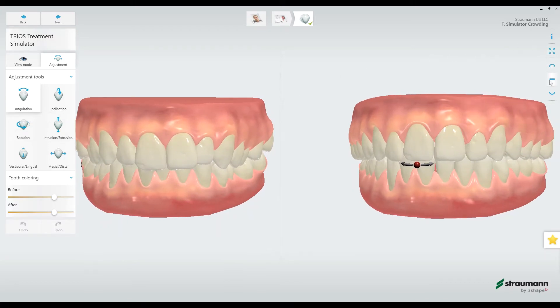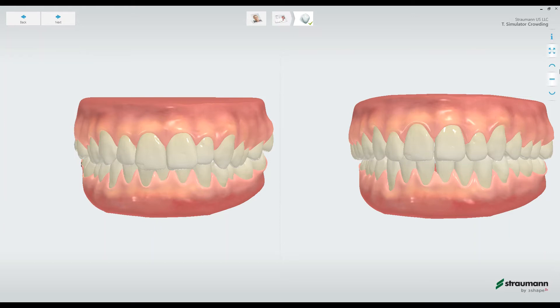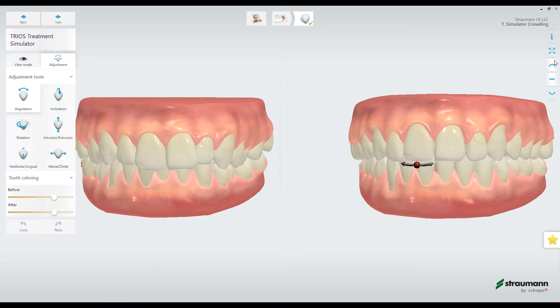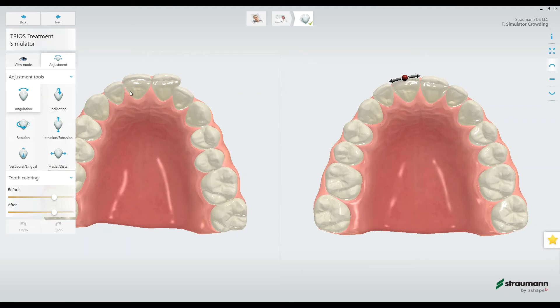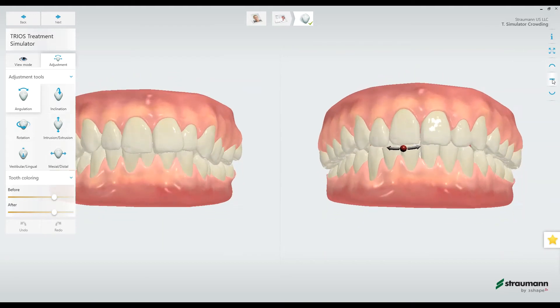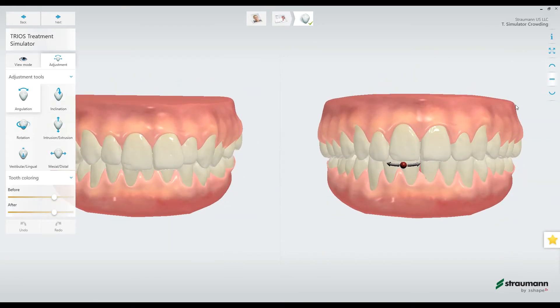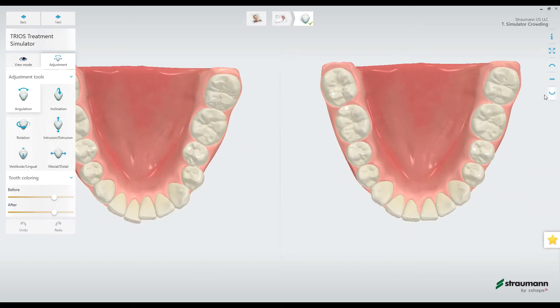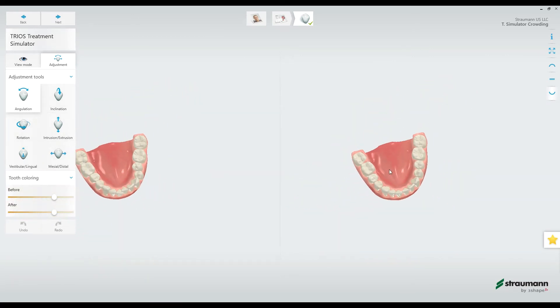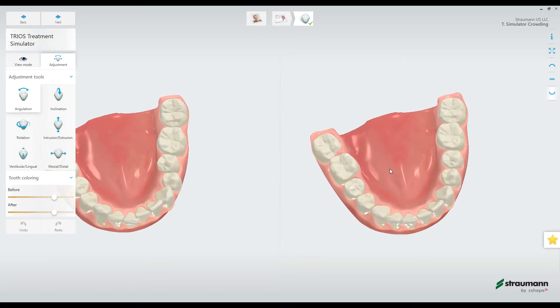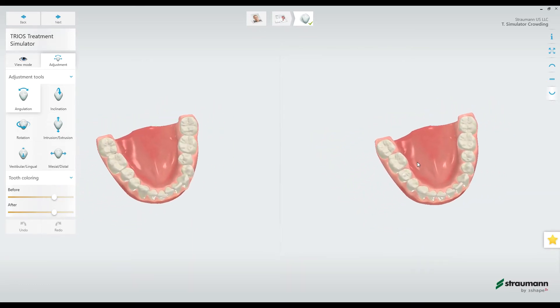Over here on the far right, I can see different view options. If I click the four arrows right here, I can see just the models and get rid of the toolbox on the left. If I click on the upper arch icon, I can see just the upper arch — the current and then the proposed. If I click on the middle, I can see both arches in occlusion, and if I click on the lower, I'll just see the lower arch. We can also use right-click on our mouse to manipulate the view in any angle, zoom in or out with the scroll wheel, and pan with the scroll wheel click.